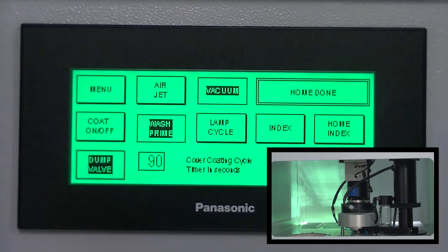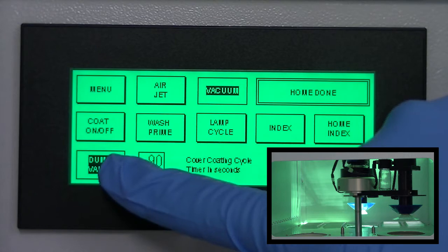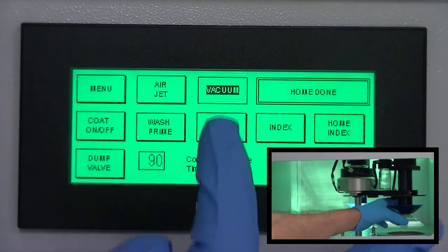Press the dump valve button to open and purge pressure. Press the wash prime button to raise the lens out of the bowl. Press the dump valve button to close the dump valve. Hold on to the lens and press the vacuum button to remove the lens.